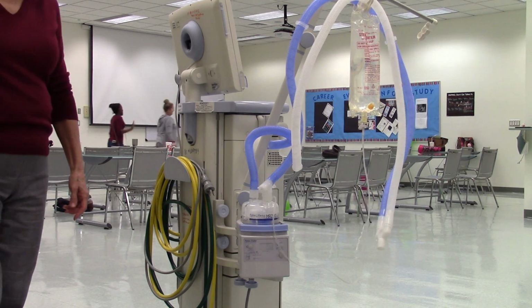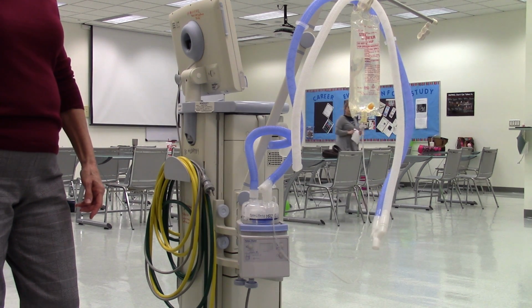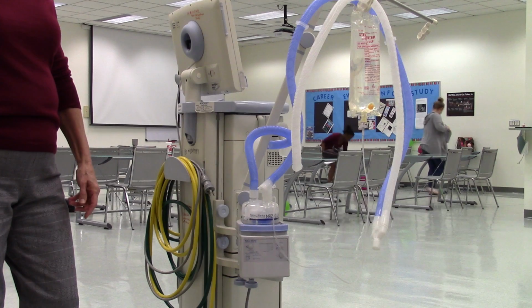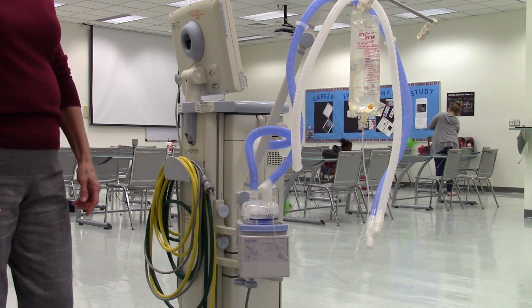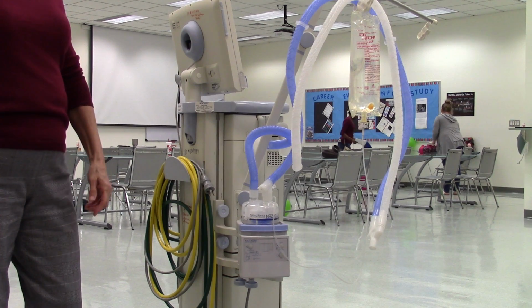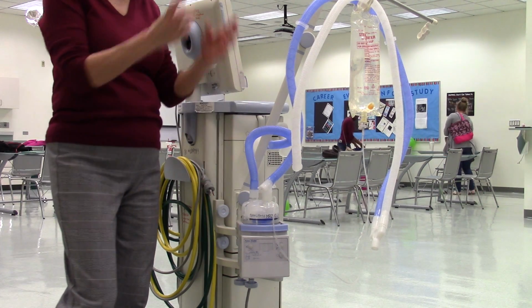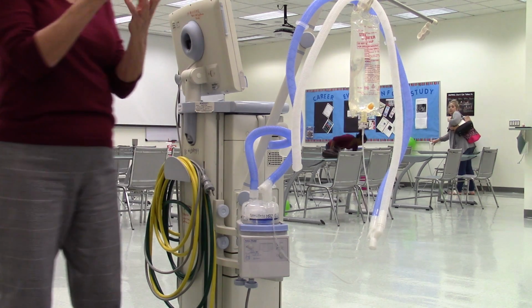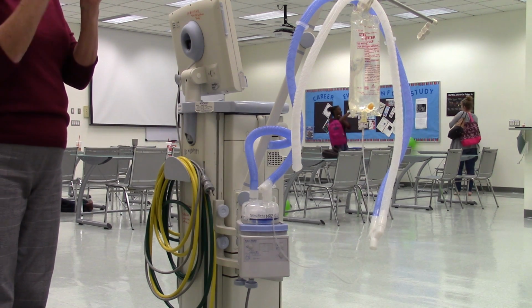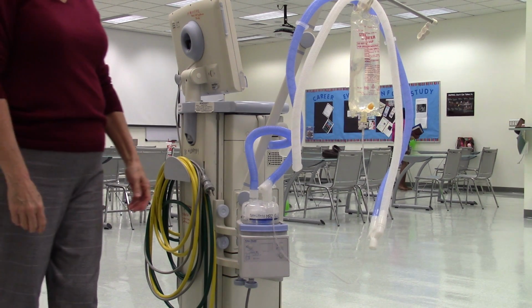On this, we could have all the same setups as we had over there with the ETCO2 and the HME and all that stuff. Would the HME not be necessary because of the humidifier? Very good. It's actually dangerous. If you have the heated humidifier and an HME, the HME fills up with water and makes it very hard for the patient to breathe through it. Oh no. Yeah, so that's a danger.